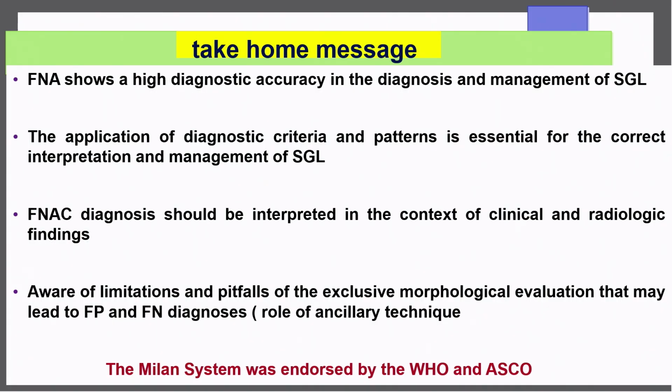The application of diagnostic criteria and patterns is of course essential for the interpretation, as well as it's important to use a classification system, and right now the only one is the Milan system, which combines the entities into categories with the risk of malignancy and management. Of course, you have to interpret the lesion with the clinical and radiological findings.